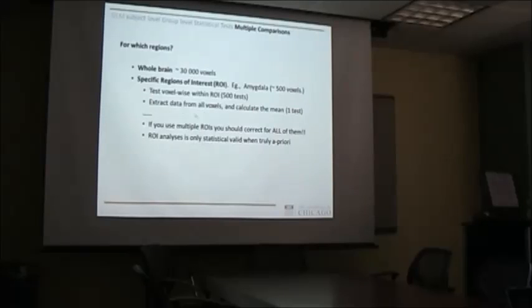There's two different things that are really tricky about this type of analysis. One is that, and actually these are things people do a lot. If you have multiple ROIs, multiple regions, what you often have is, okay, I'm not maybe interested in the whole brain, but I'm interested in the amygdala and the insula and the medial prefrontal cortex and the caudate and a bunch of these regions. And if you want to do this region of interest analysis, you should correct for all your brain regions at once. If you first correct for only the amygdala, and then you run your tests and correct only for the insula, you still ended up running all these tests again, right? So if you want to do a proper ROI analysis, you should combine all the regions you're interested in and correct for all of the voxels within these regions. And you would often see that people say you have these 10 different regions of interest and they test for each of them separately.